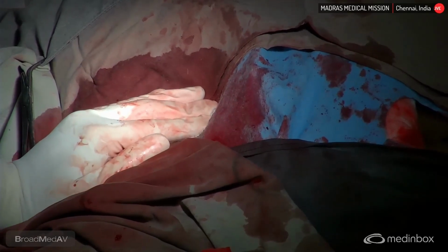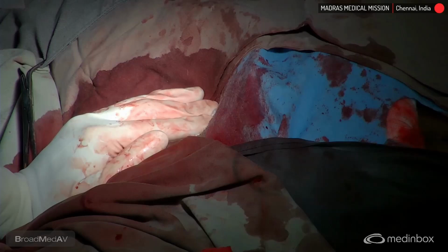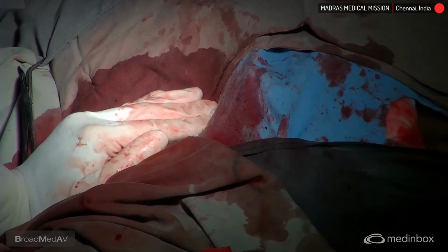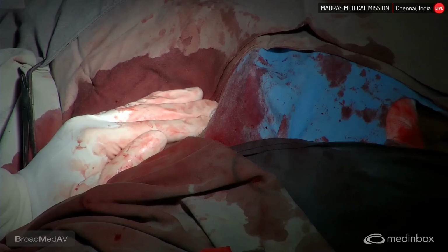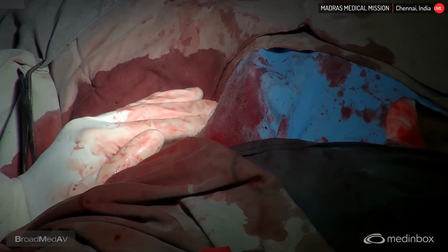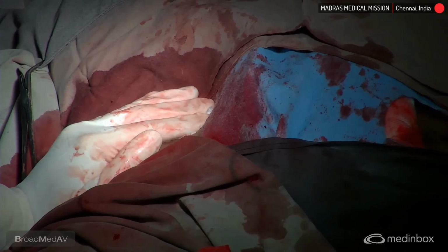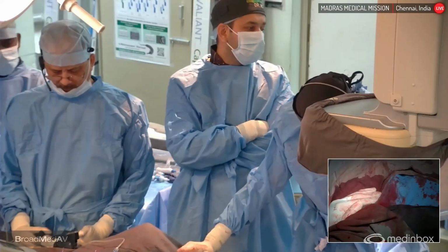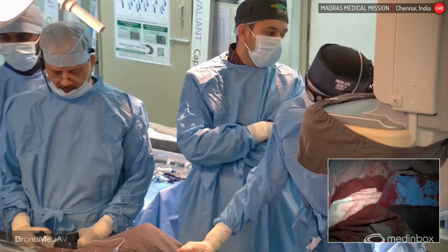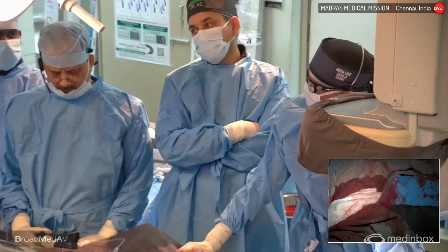So this is known as a bidirectional tamponade. One is occluding from the inside with the balloon and we are giving gentle compression from the outside. And after reversing the heparin, with the one ProGlide and angiosyl support with the bidirectional tamponade, most likely 99% it will settle down.